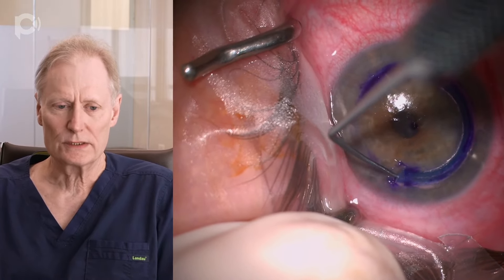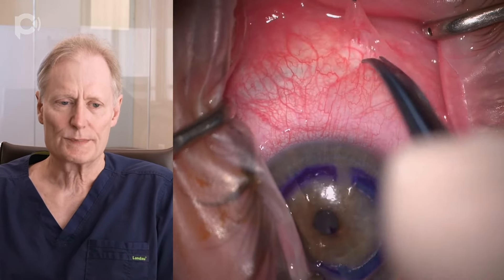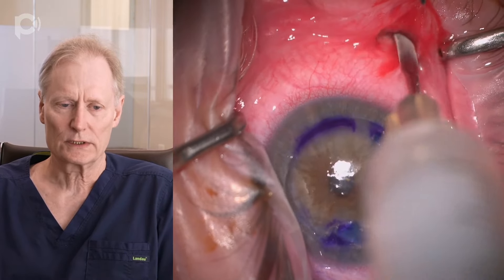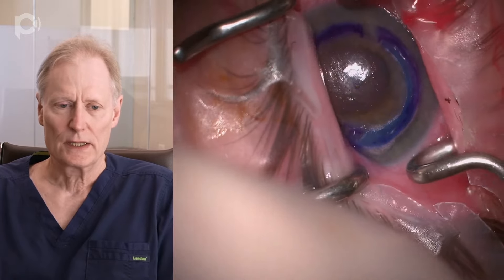What we like to do in some cases is give a little extra anesthesia, and that's what I'm doing here. We like Exparel — it's a special form of bupivacaine which lasts for several days — so we just give a little Exparel, about 2 ml subtenons, and that's the end of the procedure. This patient is going to be very comfortable and they're going to see better the day after surgery. It's a great surgery and I'm sure it's going to keep getting better and better.